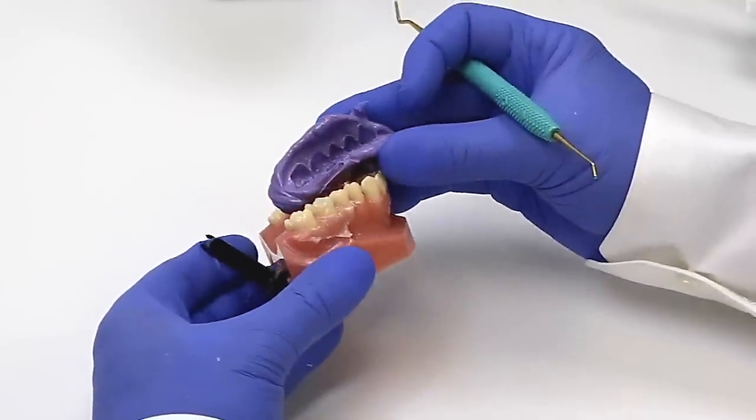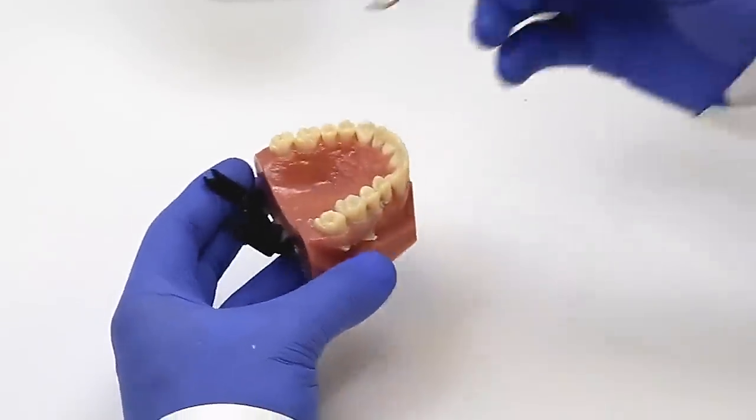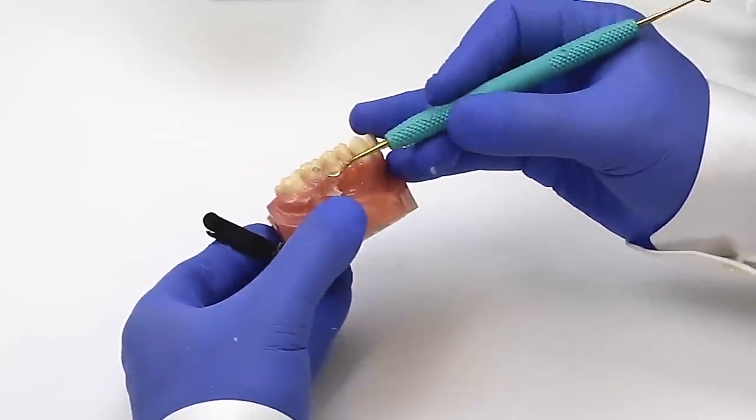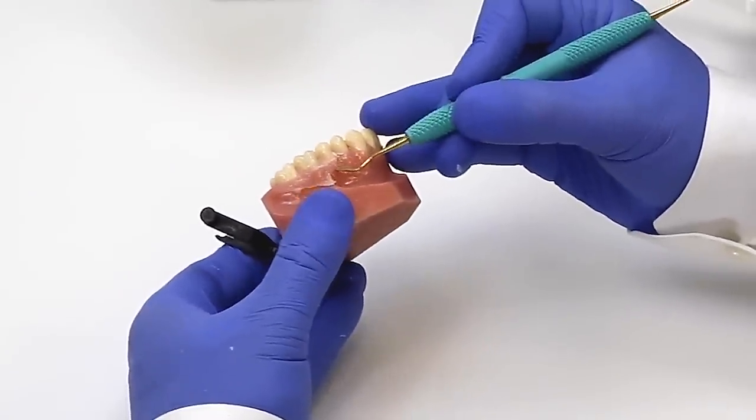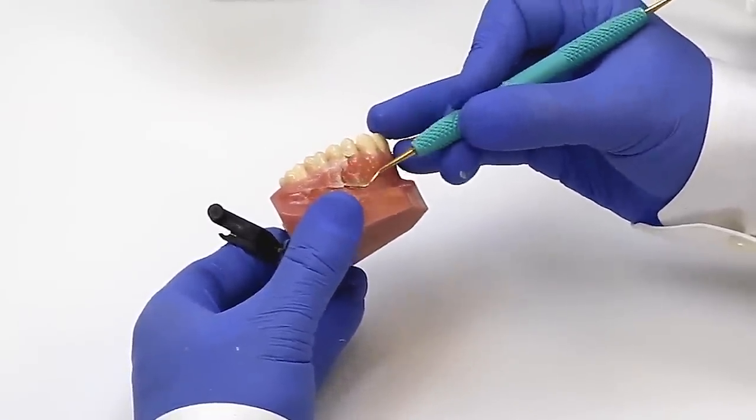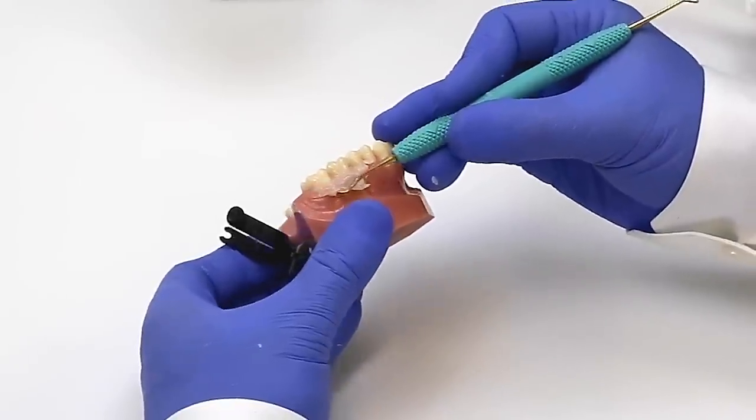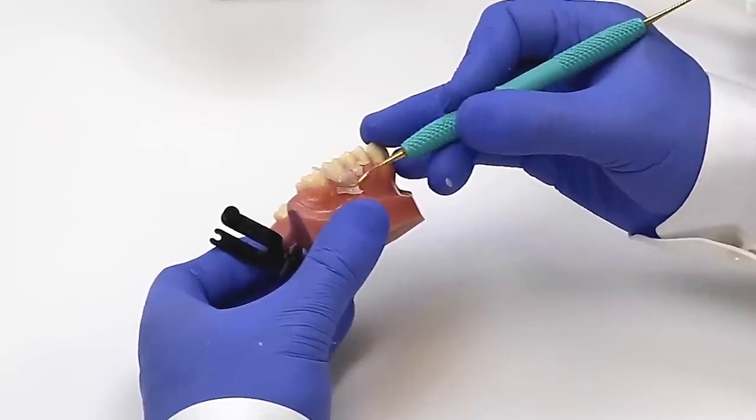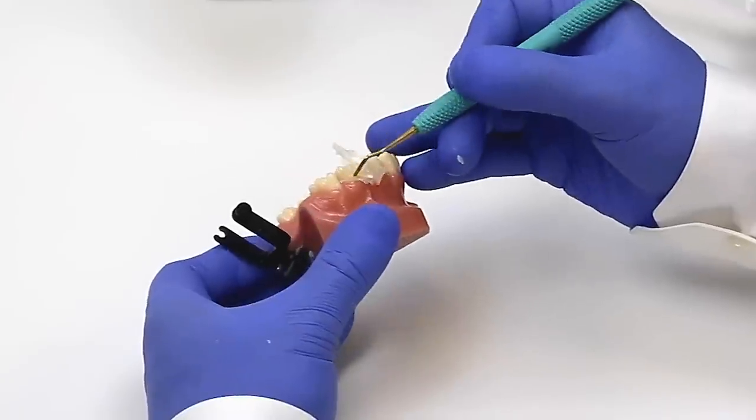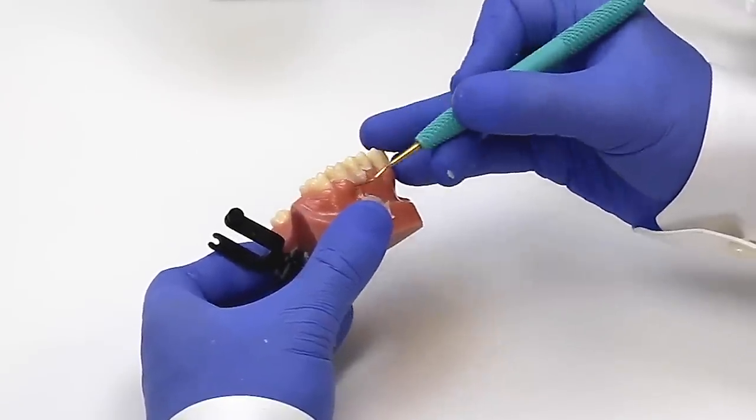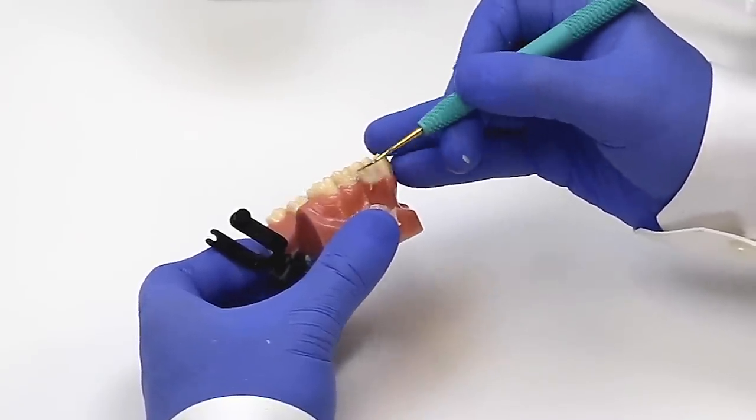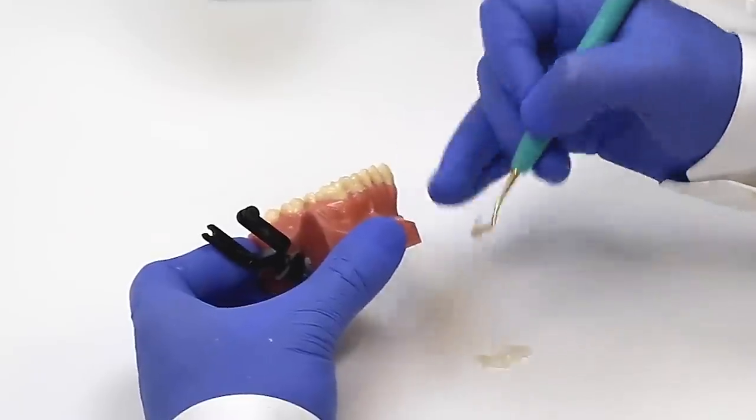We've removed the temporary matrix and what's left behind is a temporary crown. And if you see with the simple use of an instrument, this onion skin excess is removed, breaking off at the margin.